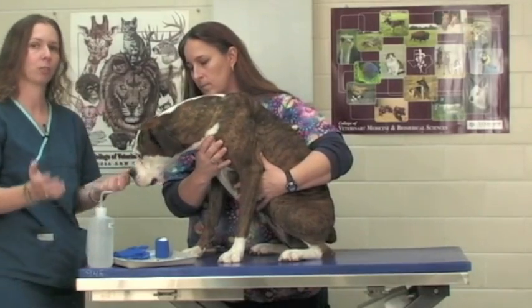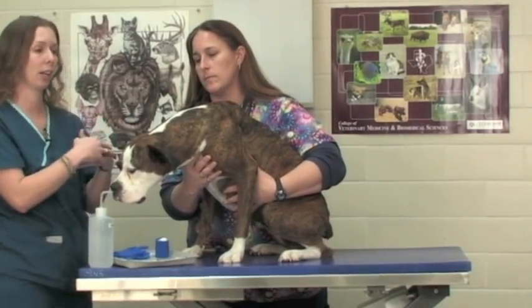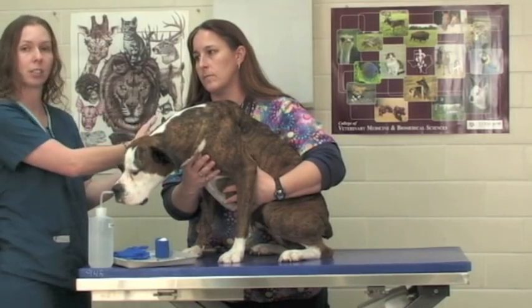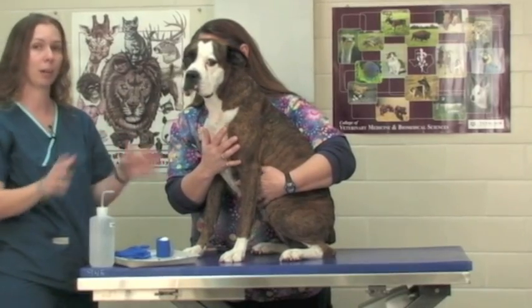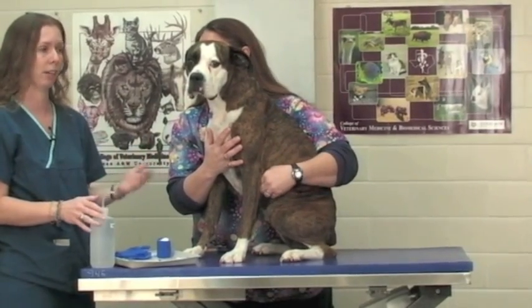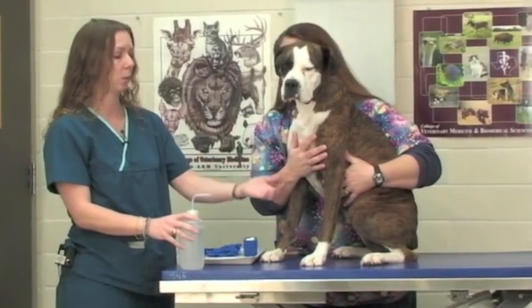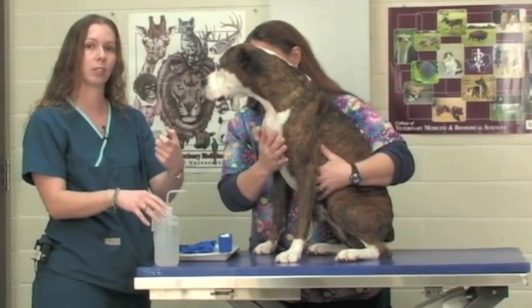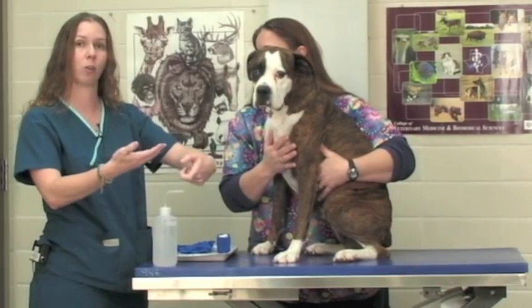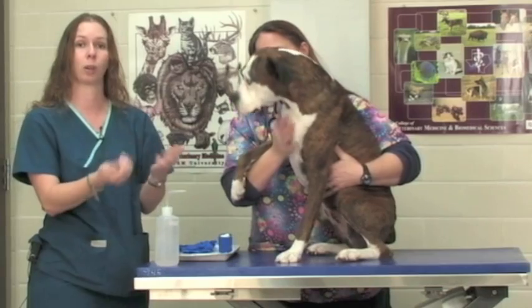For drawing blood from any vessel you need someone to restrain the patient properly for you so that your restrainer is safe, your patient is safe, and the person drawing blood is safe as well. We're going to first wet down the hair with a little bit of alcohol and then we're going to have our restrainer roll the vessel off, which will hold the vessel and make the vessel wall distend so that we can see it and palpate it and know where we're going to poke.